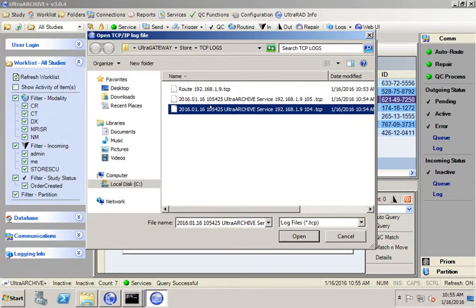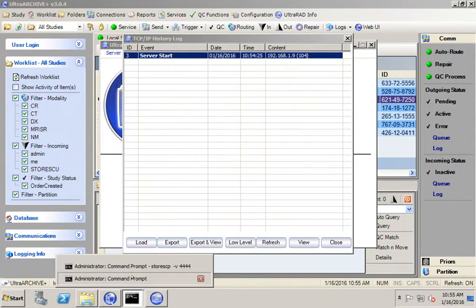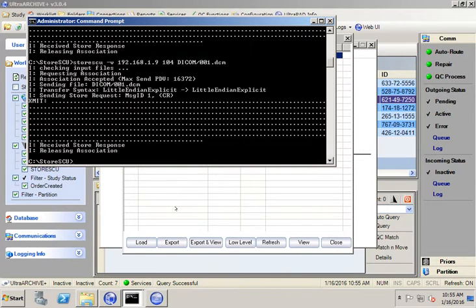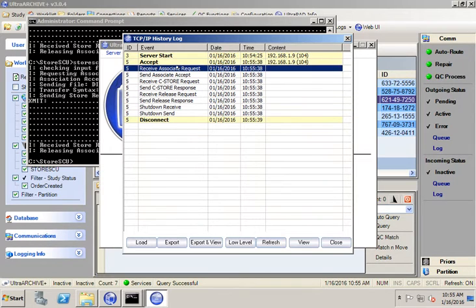In this case, I'm going to take a look at the port 104 because I want to look for information for troubleshooting for receiving a file into my Archive Plus. I'm going to open up the port 104. You can see here it says that it was started at 10:54, which was just a second ago. I'm going to go to Store SCU, and I'm going to test sending an image to my Archive Plus. This is just simulating a modality or another device sending to the Archive Plus server, to the router. So I just sent the file. When I refresh this log file, I should see some DICOM traffic, and I do.